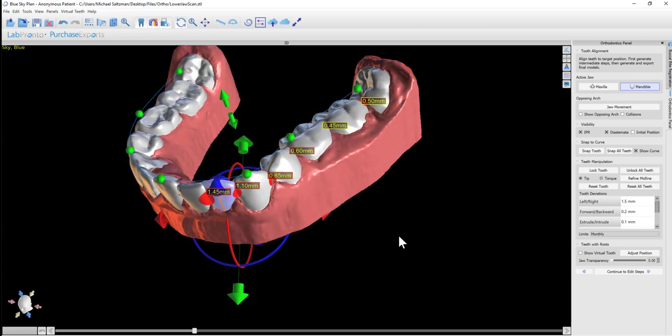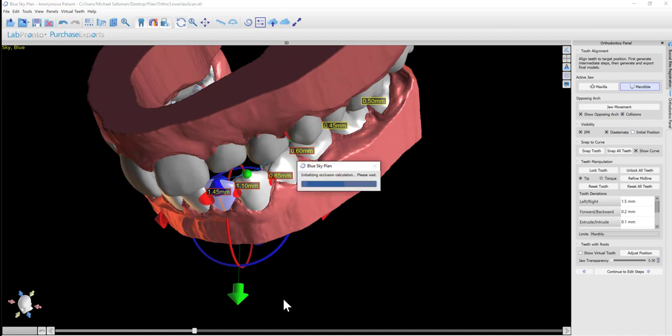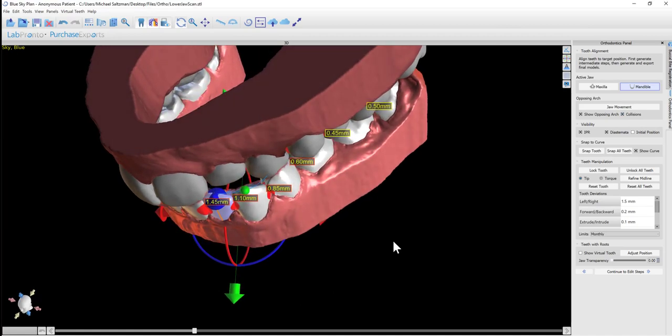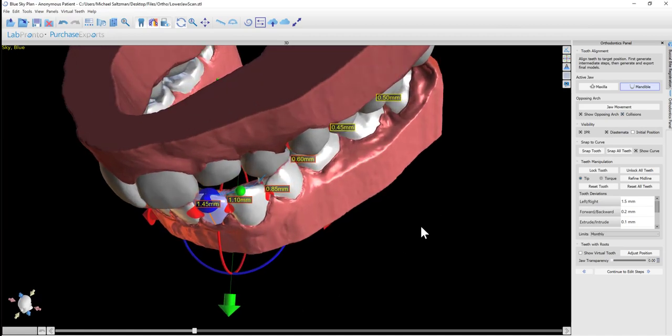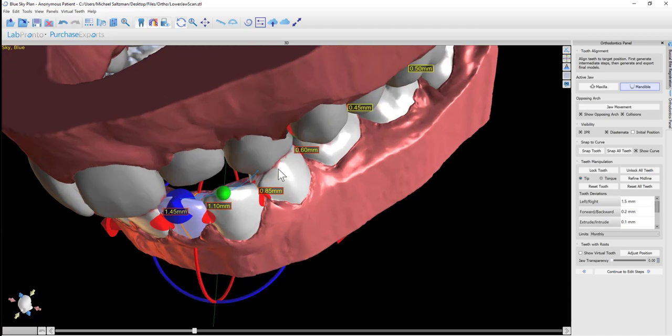We also have the ability to turn on collisions. If we want the software to show us any collisions that happen between the teeth or between the opposing arches, we can turn on collisions and as we update the tooth positioning, we can see the relevant collisions.